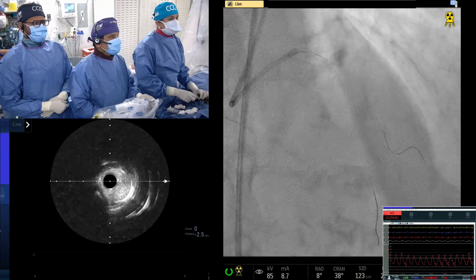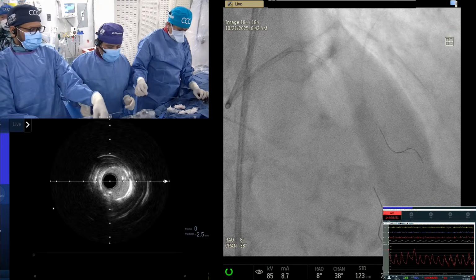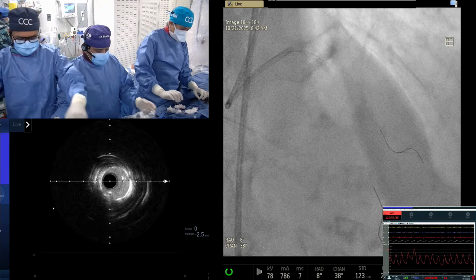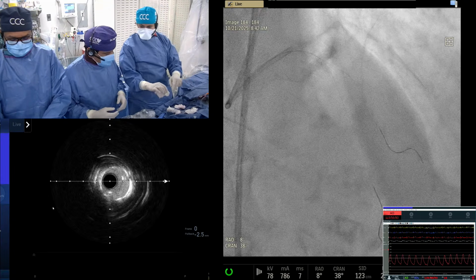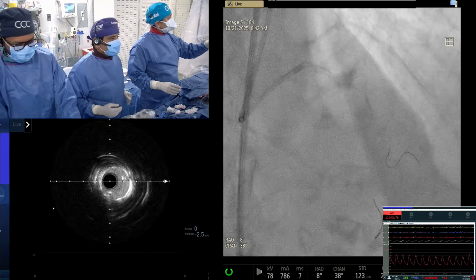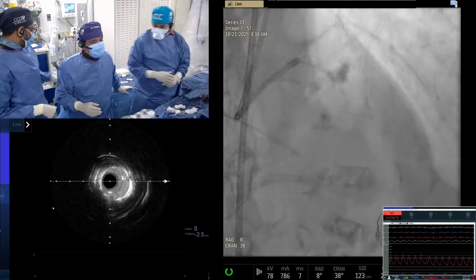This is a very unusual and a very good question. You mean IVUS? No, we are talking about IVL use. IVL use is very much increasing because we are in randomized trials where the IVL is provided free. That's one of the reasons, a very big incentive. But otherwise, our IVL use has been around 10 to 12%.